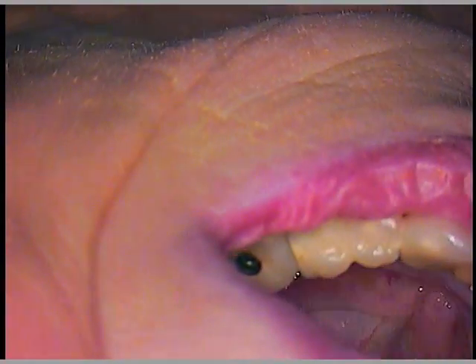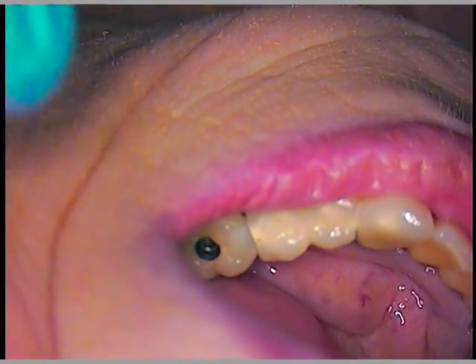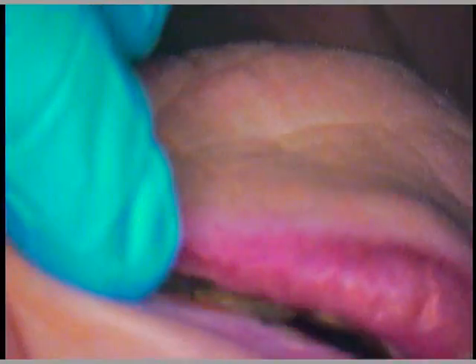Continue to tighten, continue to check floss — so I can make sure we're not too tight. That's good, still snapping floss good. Open wide please. That is tightened down by hand, checking the floss again — perfect. We'll go ahead and snug this up and then put the Teflon in. Feels better now. We'll be done in about five minutes.